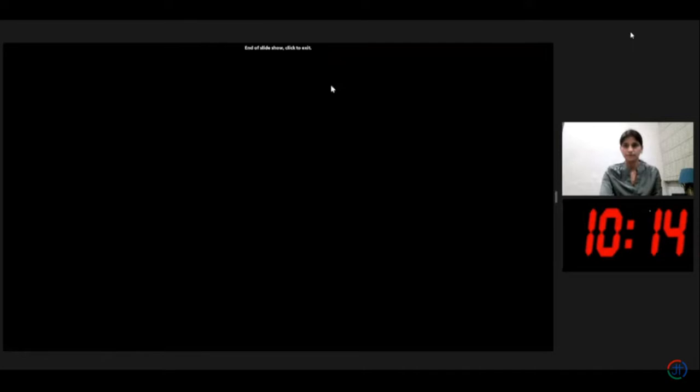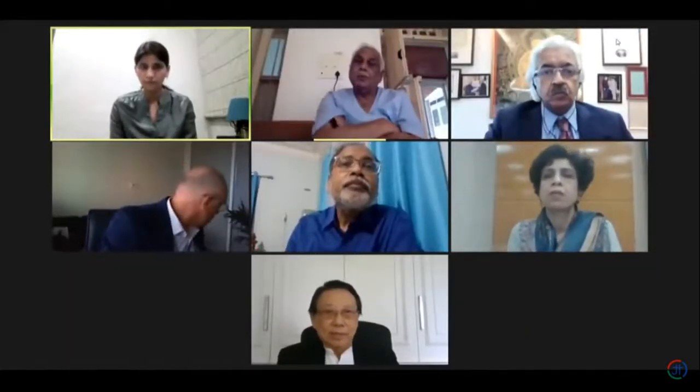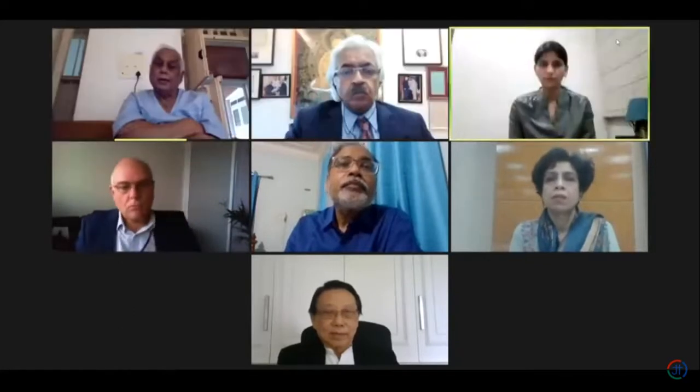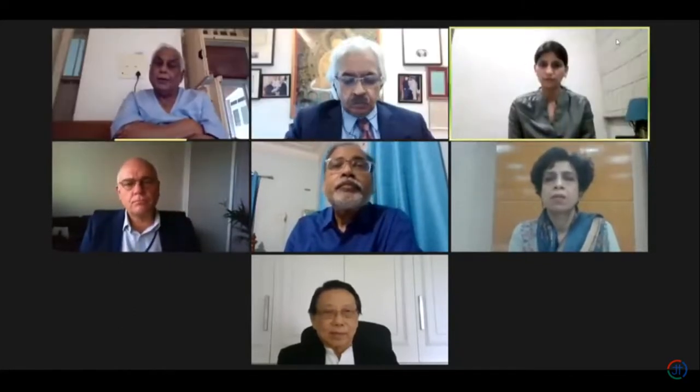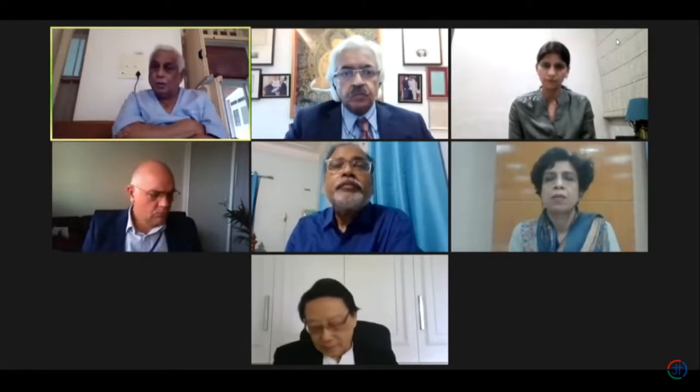Before it's thrown open to the discussion, I just want two clarifications from you. One, I heard you presenting that you, on and off, tried to get a high pressure balloon on the rotablator wire itself and inflate the balloon. The purpose is what?